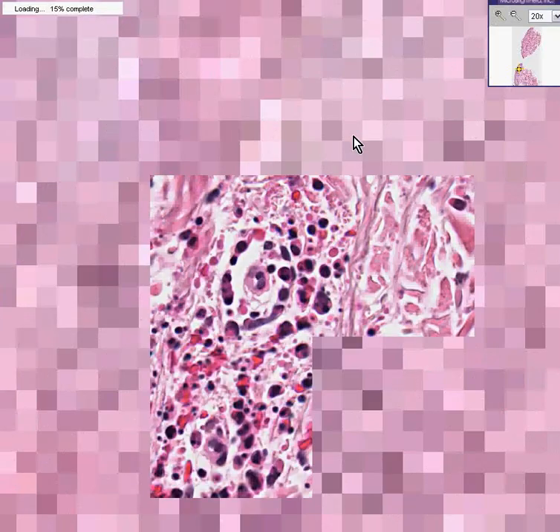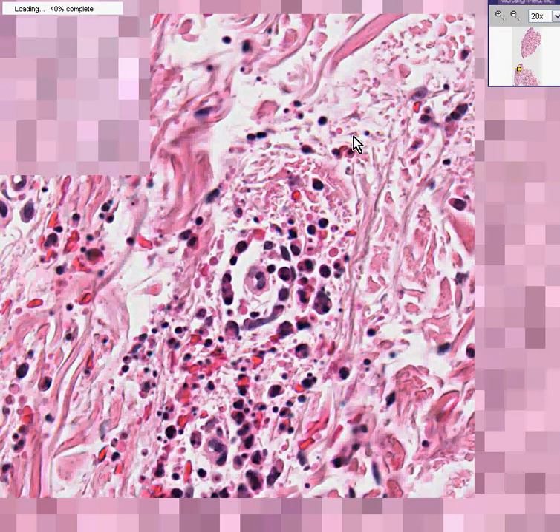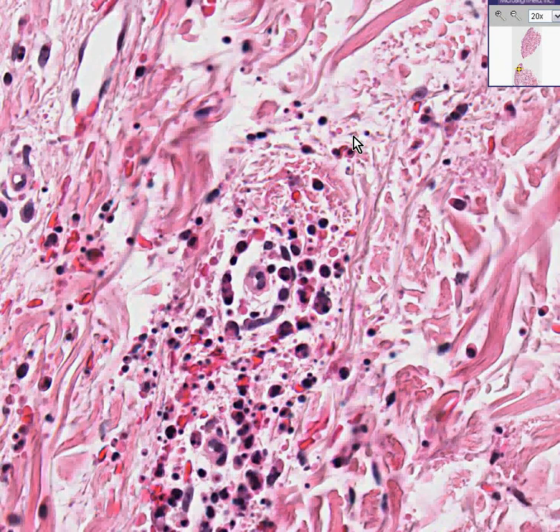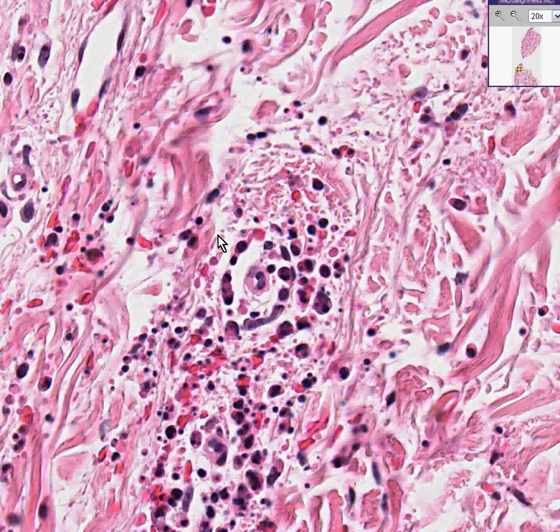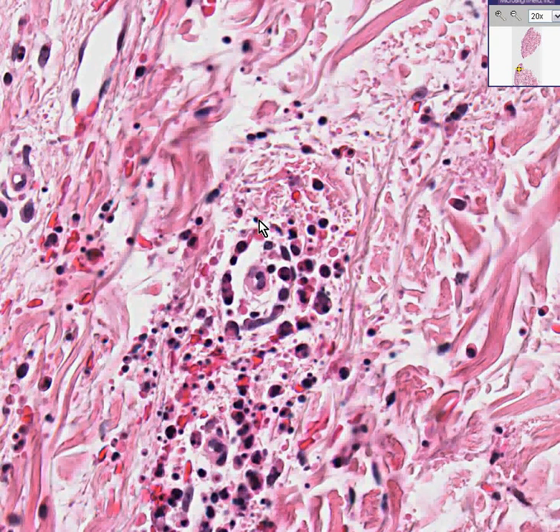Leukocytoclastic vasculitis is still a rather obscure disease. It is seen in association with bacterial infections, autoimmune disease, and drugs. But the fact is, at least half of these cases the etiology is completely unclear. From a morphologic definition, leukocytoclastic vasculitis is a vasculitis within the skin in which the surrounding leukocytes or neutrophils are fragmented — the nuclei are shattered. The nuclei visible here are not whole; they are fragmented, they are clasted. So: leukocytoclastic vasculitis.